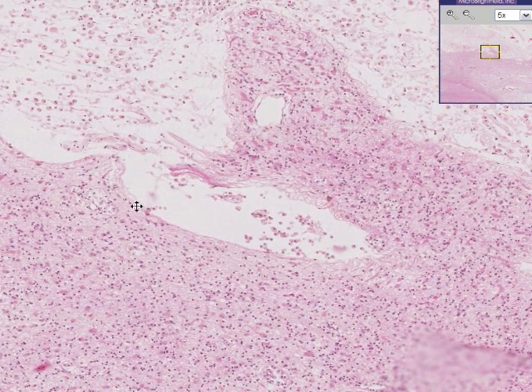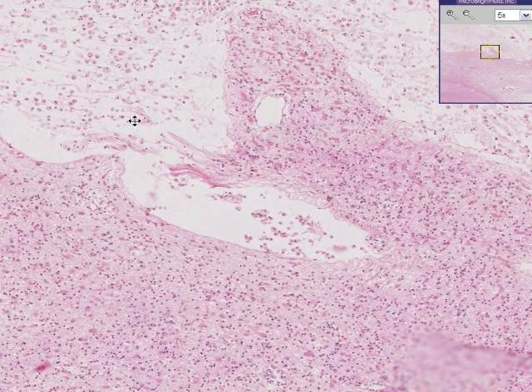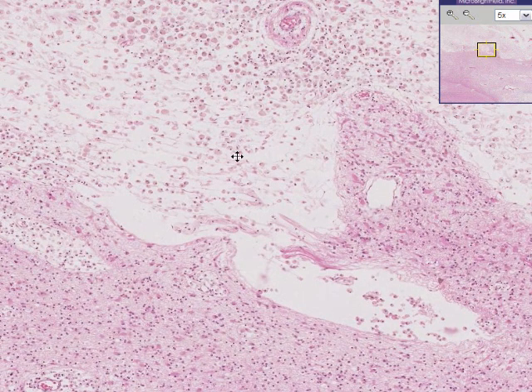But sticking to basics of the three general non-specific ways brain tissue can be injured, liquefactive necrosis is one of them and that's what we're seeing here.